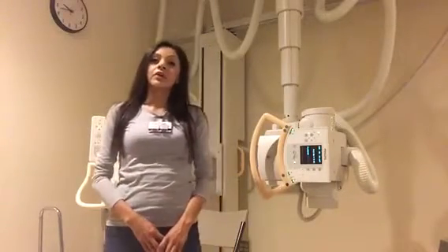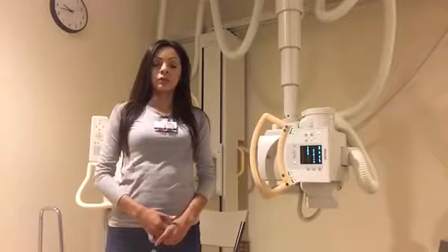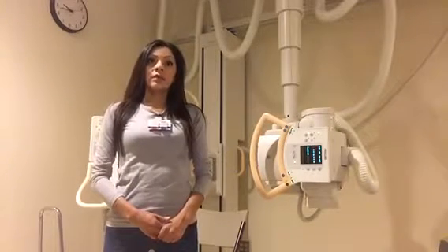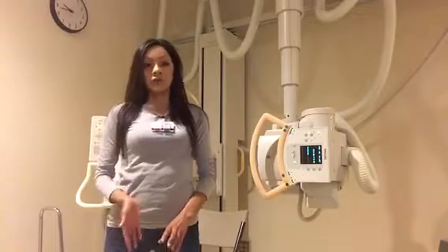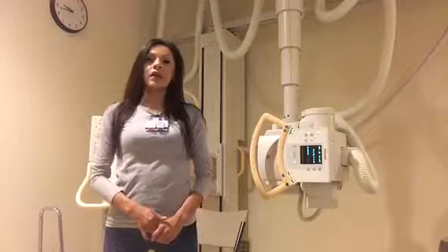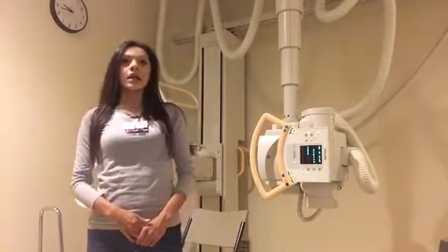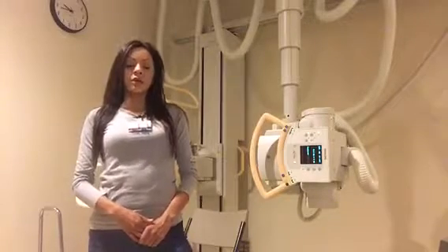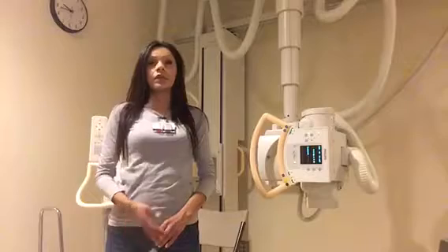Hi, my name is Yahida, and I'm going to be doing a series of the paranasal sinuses. The projections that we're going to be doing are the lateral paranasal sinus, at a technique of 85 at about 3. The next projection is the PA Caldwell, frontal and anterior ethmoid sinus. With that projection, we're going to be using a technique of 85 at about 7.